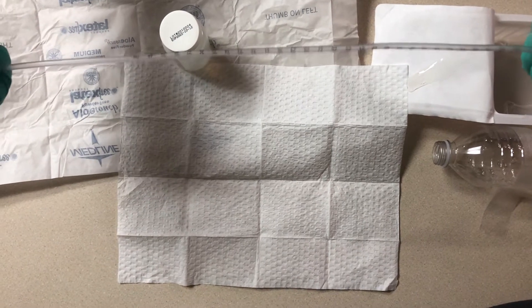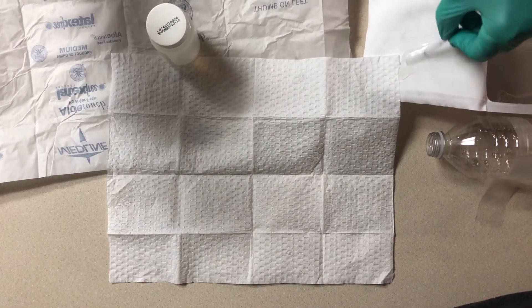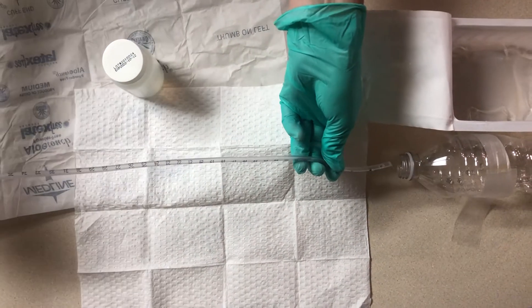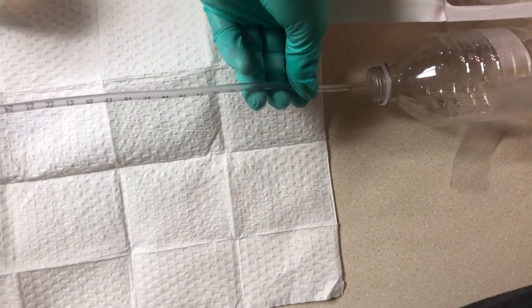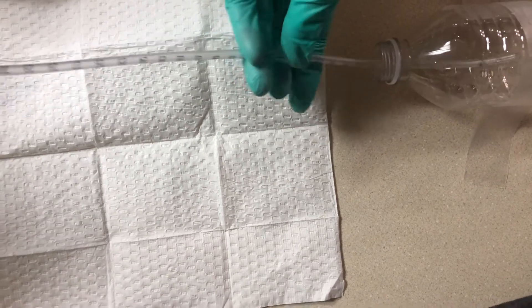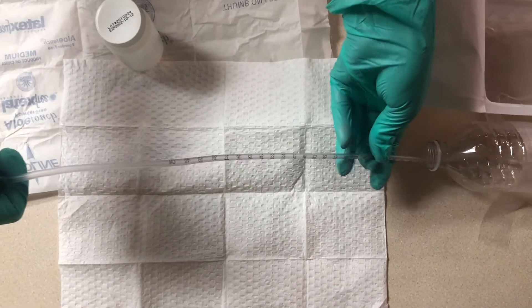Test your suction. Get some of your lubricant, and then very carefully put the catheter in the nare without touching the tip.